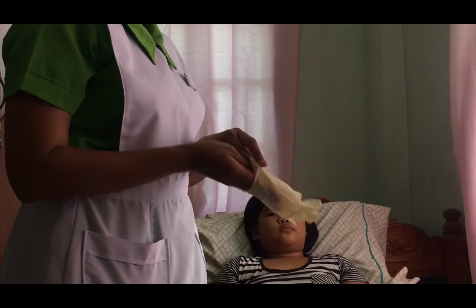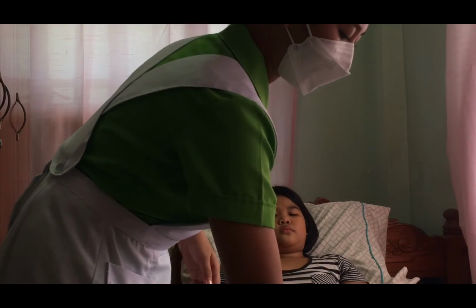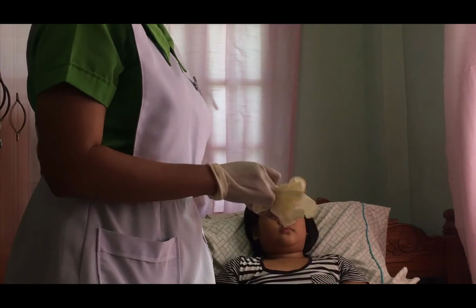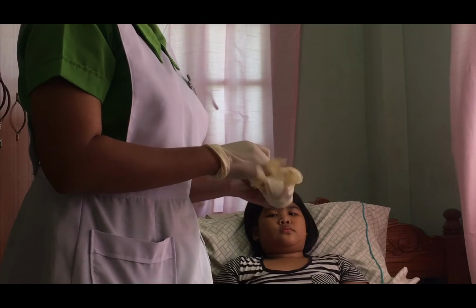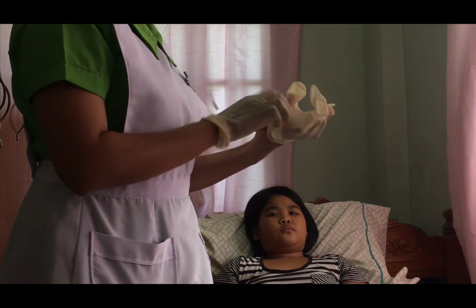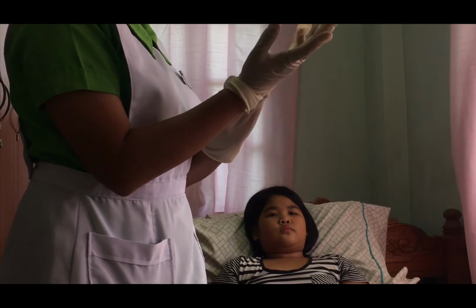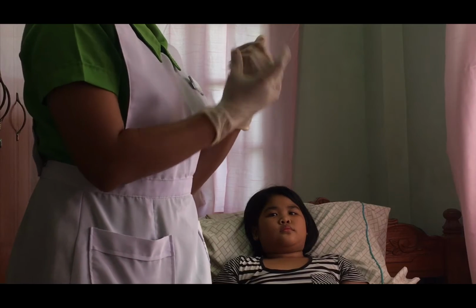Don gloves. Examine the nostrils of the patient for any deformities or obstructions to determine the best site for insertion of the nasogastric tube.